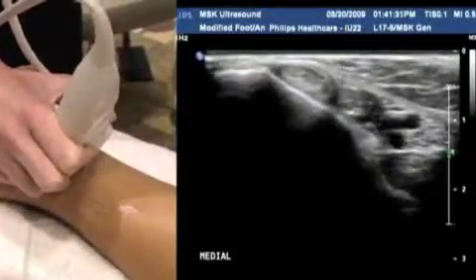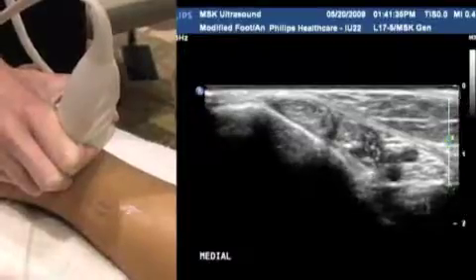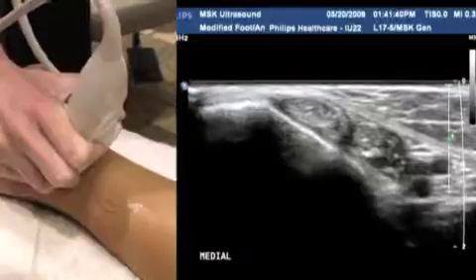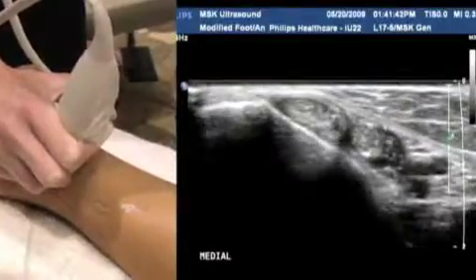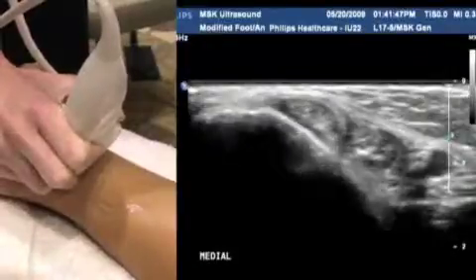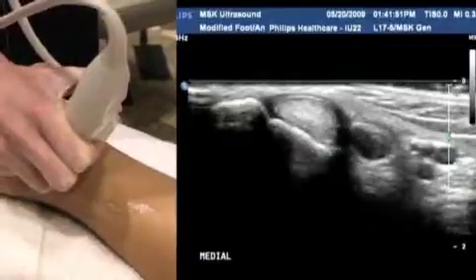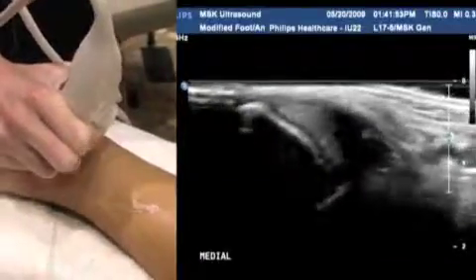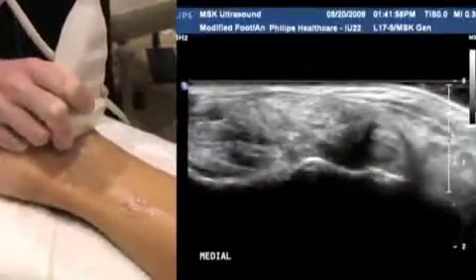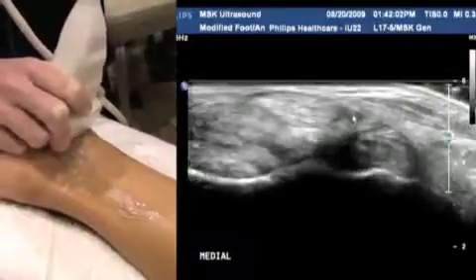So let's go and focus on our tendons now. Let's look at the posterior tibial tendon, first of all. It's the guy right at the top here. Again, we're going to start quite proximally and we're going to follow it all the way down, heel toeing as we go, making sure it stays nice and echogenic. As it goes around the malleolus, it can be difficult. Again, underneath the retinaculum that you can see here. Following it all the way down distally.